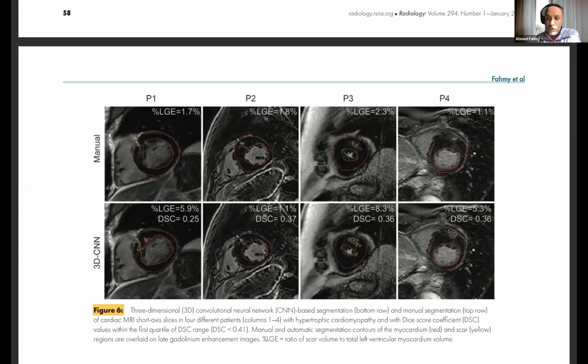In this study, we did not use a validation data set. We let the network be trained for 2 days. And then we used the final model after there was almost no improvement on the training data set, not the validation data set, and we used it for testing. We did this guided by our previous study that we do not suffer from overfitting in this application. And you can see there is no overfitting because the diversity of the images actually prevents overfitting. And if there is overfitting, then it would lead to a lower performance in our method. So we opted to use all that set for training to improve the performance and maintain a large data set for testing.